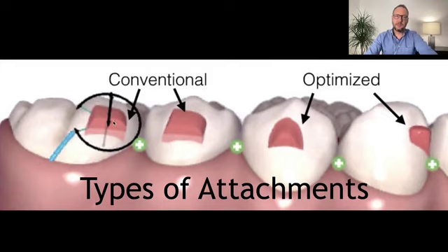Some software doesn't allow this, and then we need to write to the technician from the company to say, please insert a rectangular attachment, so it is important for us to understand how to describe this, and we will discuss this in this course. But when I talk about conventional, I mean those with specific shapes, and I'm going to explain what these shapes are.